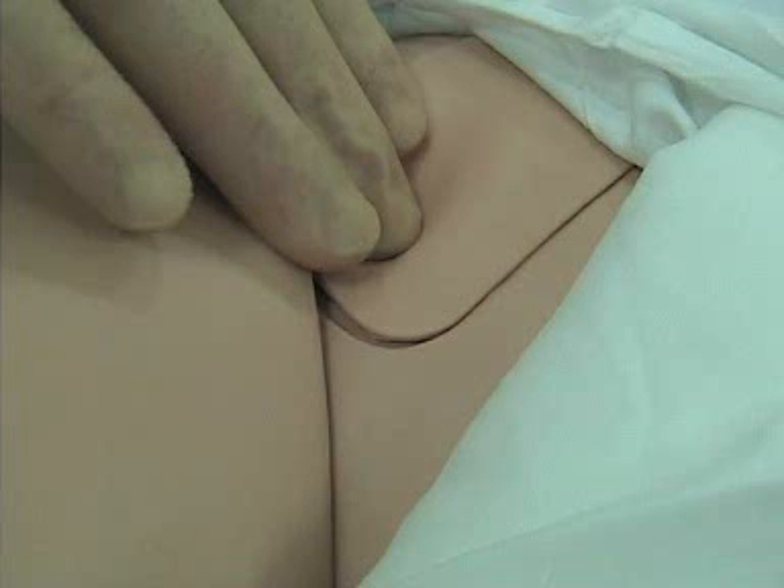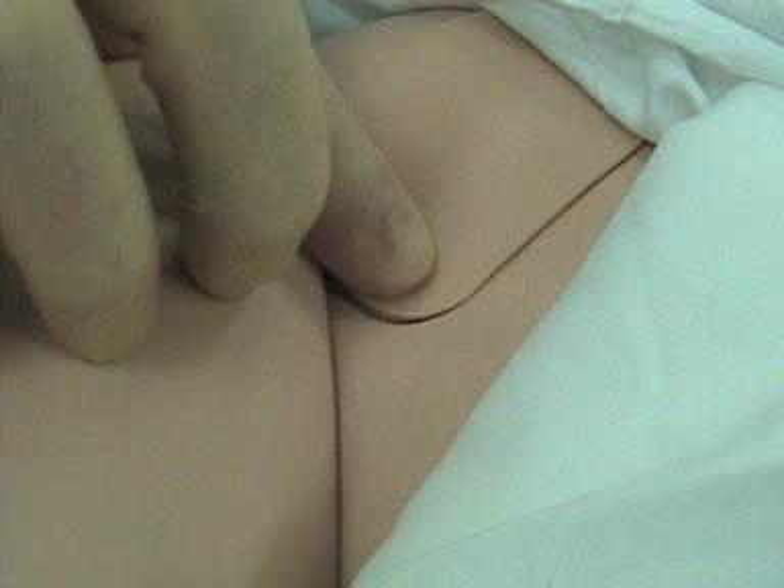Now it's time to put in some femoral lines. Remember from lateral to medial you're talking about nerve, artery, vein — going from lateral to medial. The key thing here is always going to be palpating the artery and going from there. The vein is going to be just a little bit medial to the artery.